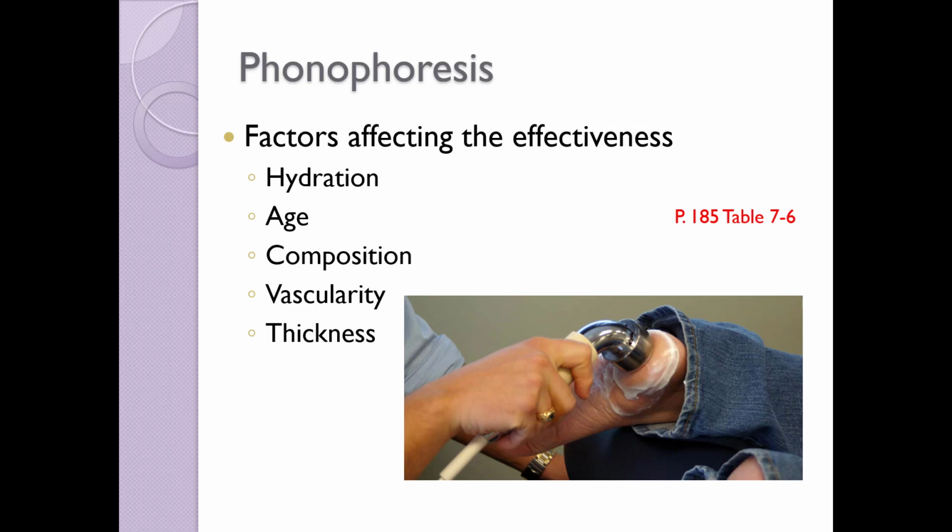The skin thickness of the treatment area. Thick skin presents a much more cumbersome barrier to medication than does thinner skin. When applying phonophoresis to an area, attempt to administer it over areas of low skin density. For example, when treating an individual suffering from plantar fasciitis, apply the medication to the medial-inferior aspect of the calcaneus rather than on its plantar surface.